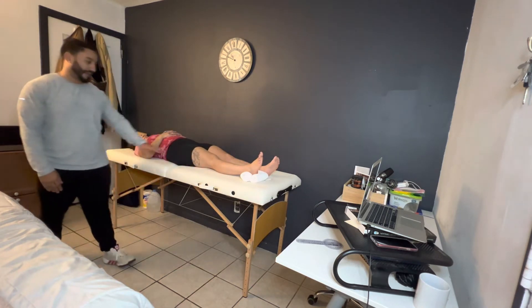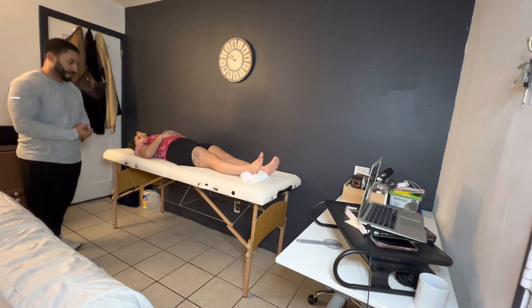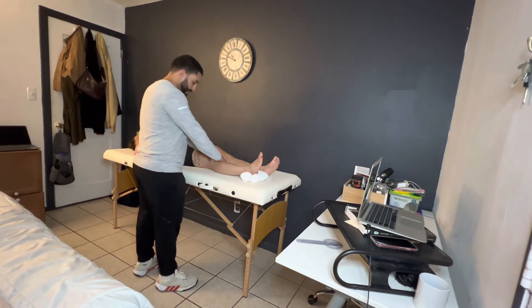Push the bottom of that leg into the bed now — do it about three times for me. Two, one more time. Perfect. Any pain there at all? All right, I'm going to do the same thing here — push a little bit more, see if we can go a little bit further, test that passive range of motion.